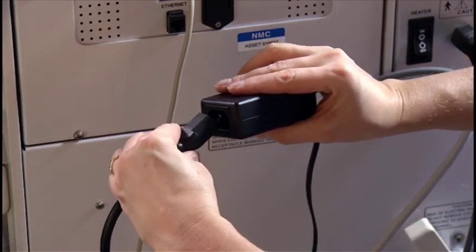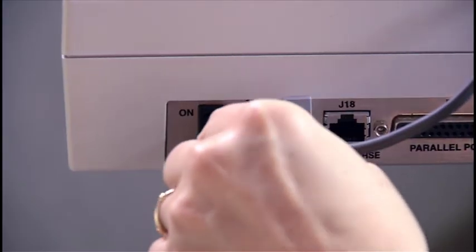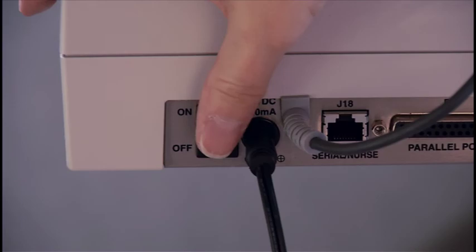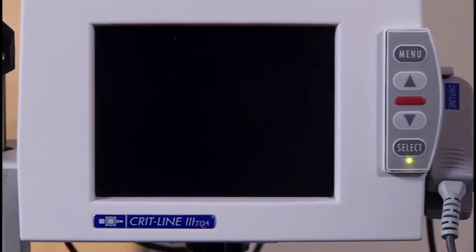Connect the universal power supply cords together and attach to the back of the monitor. Turn the power button on. The green charging indicator light on the bottom of the button pad should illuminate.